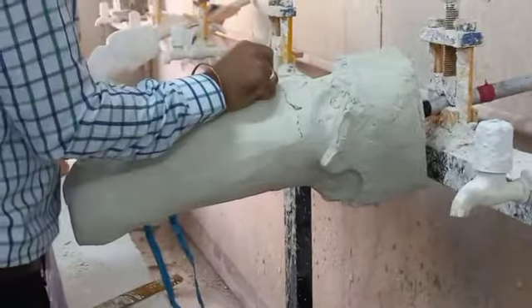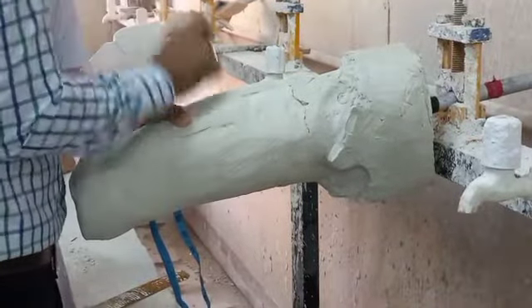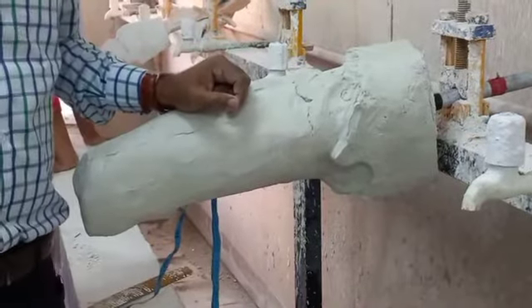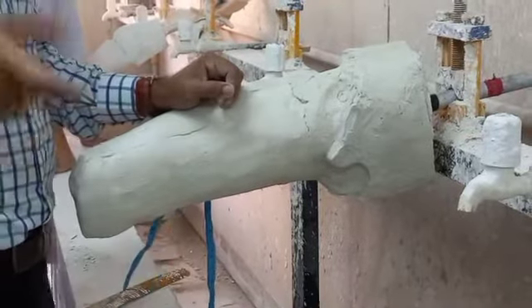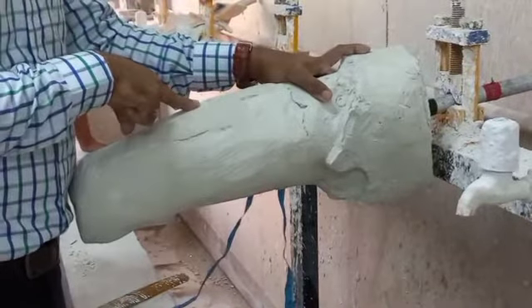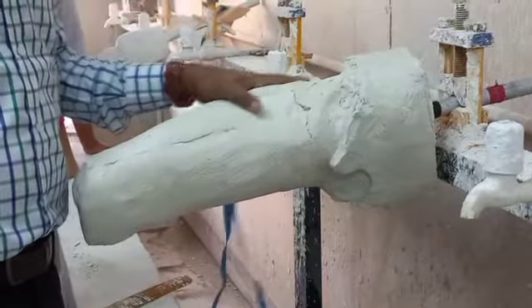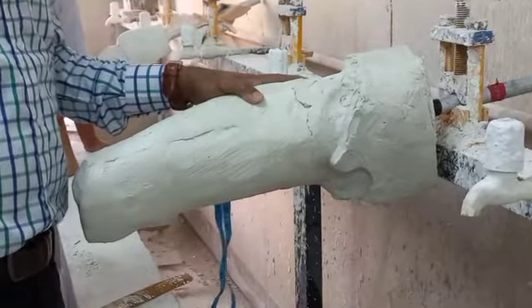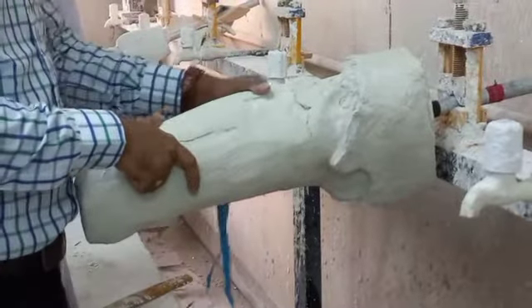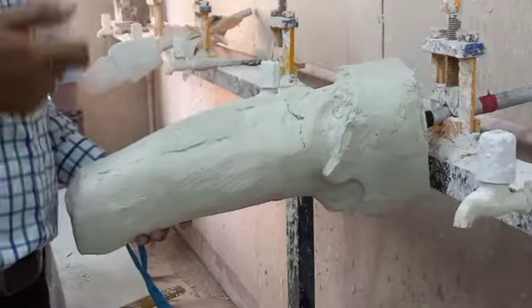Most of the modification is already done during the casting, that we must care for. Whatever the biomechanical loading is, that loading is already given during the casting. So I will say this stage of our modification is just giving a little more clearness, smoothness, final rounding. It's not for doing much work of plaster reduction.